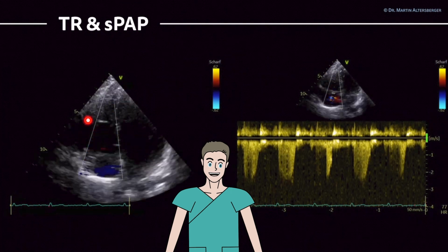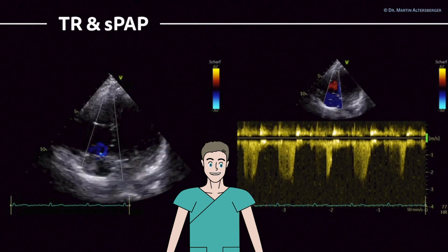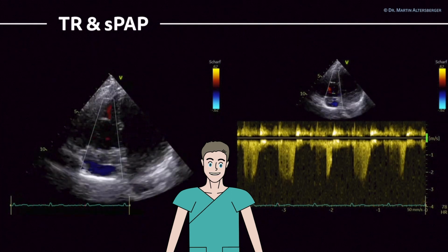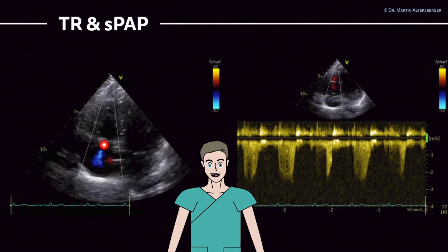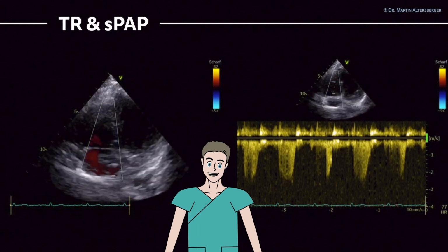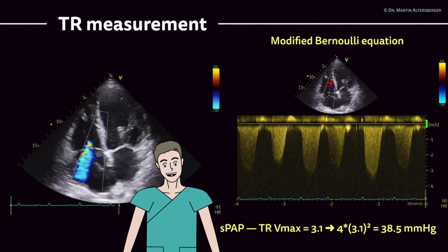You see here the right ventricle and the left ventricle, they look rather round. It is one intercostal space up, so a foreshortened four-chamber view. In case of TR, it is sometimes easier to foreshorten and move one intercostal space up to optimally visualize tricuspid regurgitation. In this case, we also do see TR.